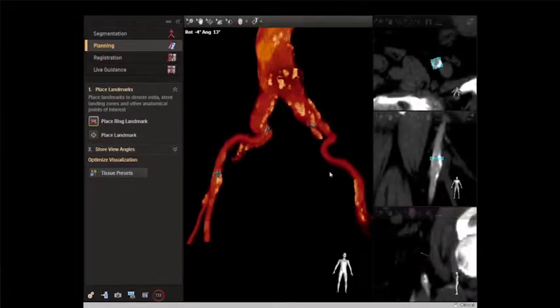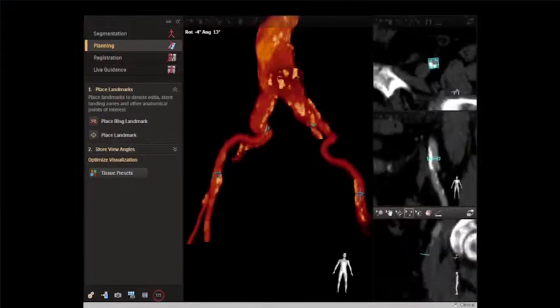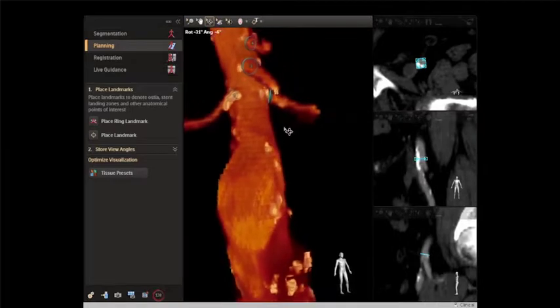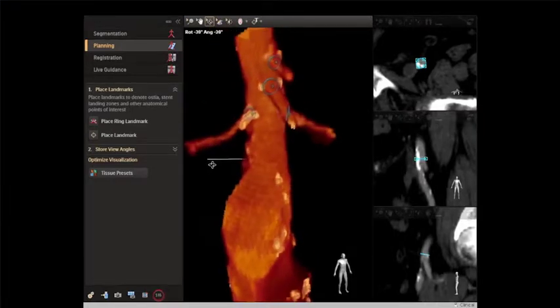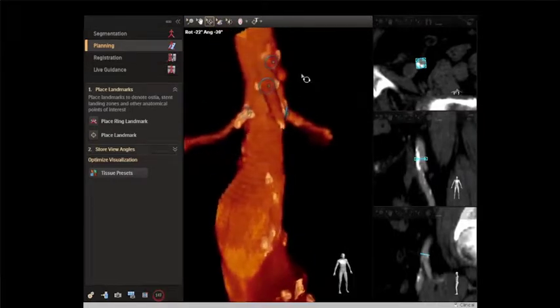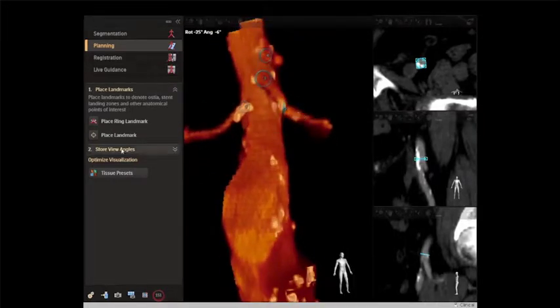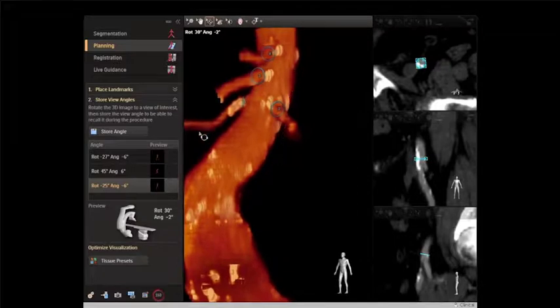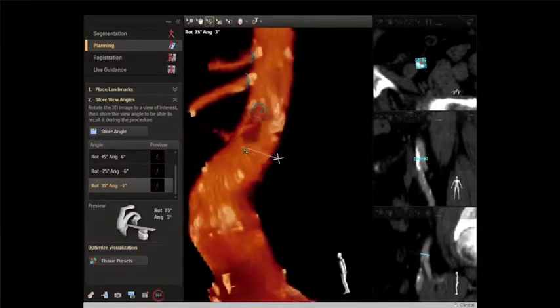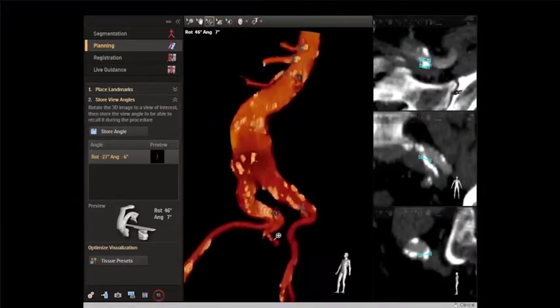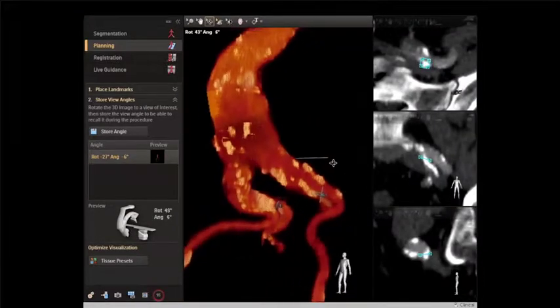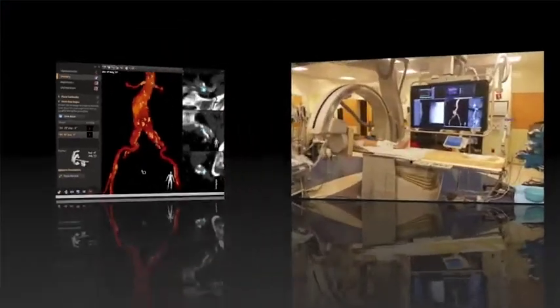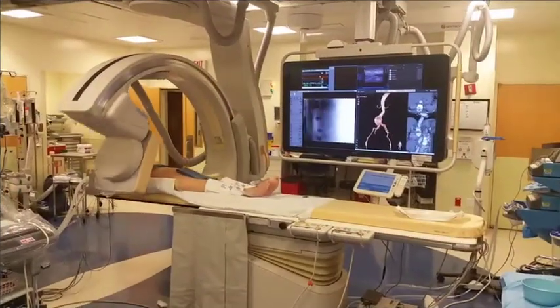Once all marks are in place, we look at the correct C-arm angles that will show those origins best — the ring markers really help with that. We can store all of those C-arm angles for later recall at the bedside. All of this planning can be done well ahead of time.